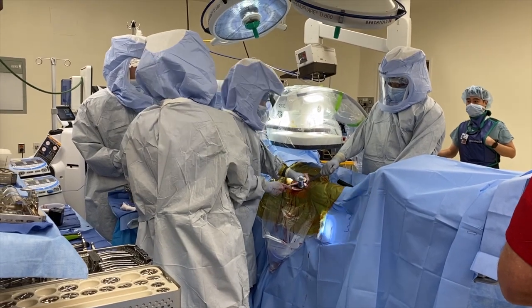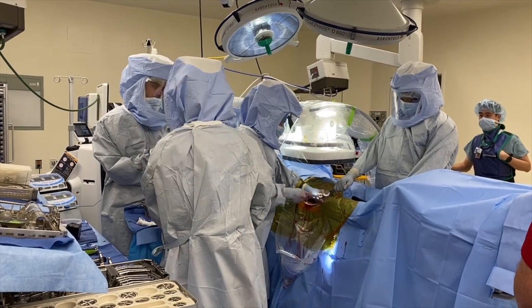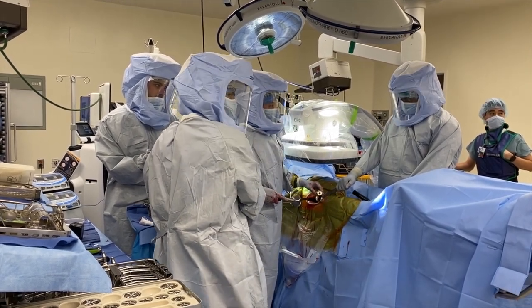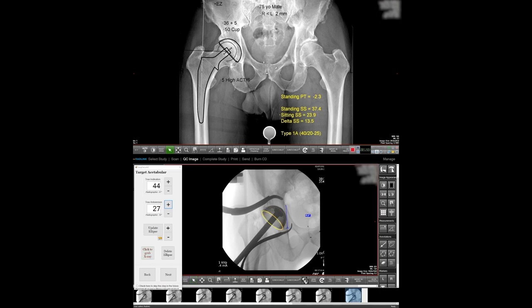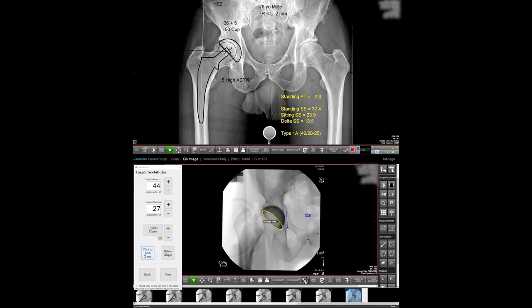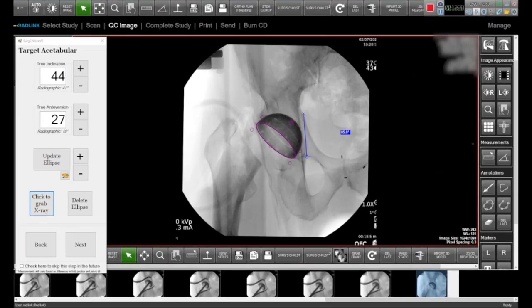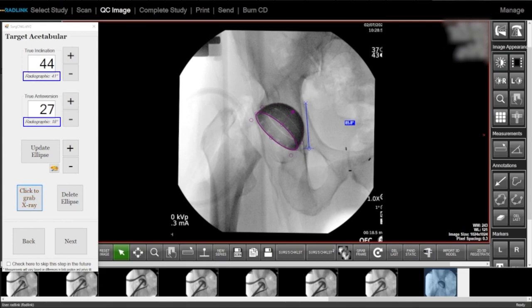Then I get into the case, and the first thing I like to do is use RadLink for my cup measurements. You can see here we've put the cup in measuring 44 degrees of abduction and 27 degrees of anteversion, which are anatomic numbers, and you can also read these numbers in a radiographic form if you prefer. Our target goal for the cup preoperatively based on spinal pelvic parameters was 40 degrees of abduction and 20 to 25 degrees of anteversion. We ended up at about 41 degrees of abduction and 18 degrees of anteversion — pretty much right where I want it to be.